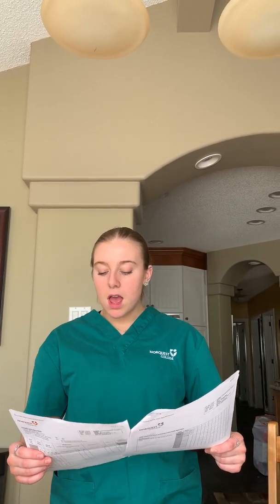Then I will take my MAR and my doctor's orders and compare them to ensure we have the right patient, which is Roger Stevenson, the right medication, Humulin, the right dose, which is 12 units, so 0.12 ml, right time, which is 8 a.m., and as well the right route, which is subcutaneously. After we check that and ensure that they are both the same, we will then do our 5 checks, our 5 rights and 3 checks.